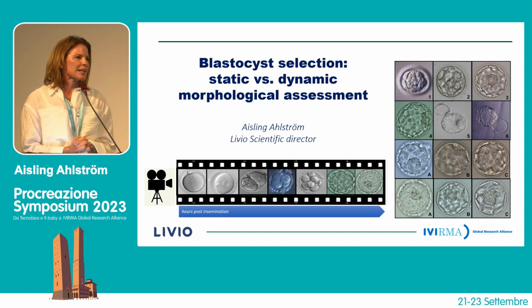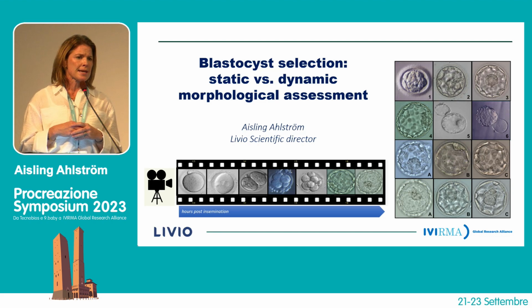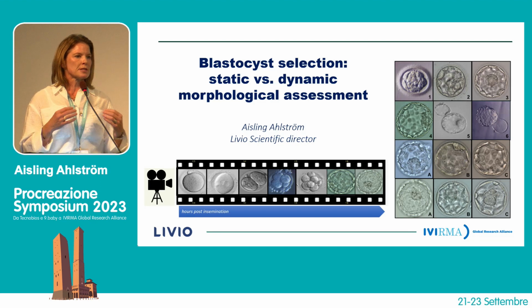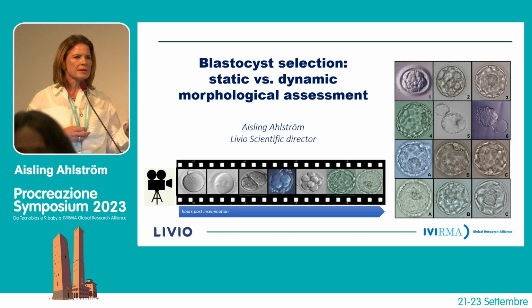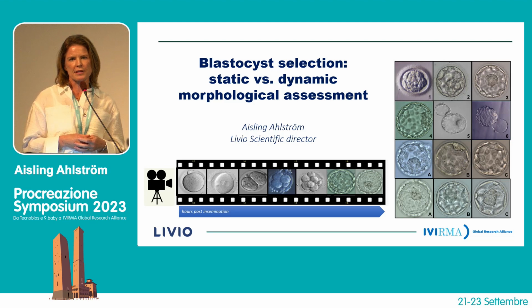I'm going to talk about blastocyst selection, and just to put a little bit of context, in the country where I work, in Sweden, we're not allowed to perform PGT-A, so much of the selection that we perform is in fact using non-invasive methods, and those are the ones that we test. So blastocyst selection for us, using either static or dynamic assessment, has been a real area of interest because we want to see a clinical effect in how we're performing IVF.